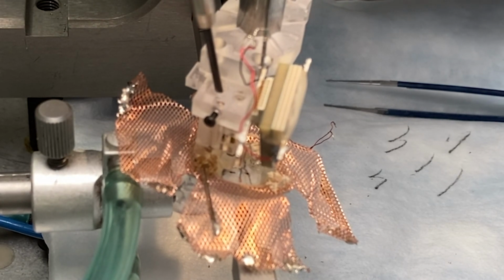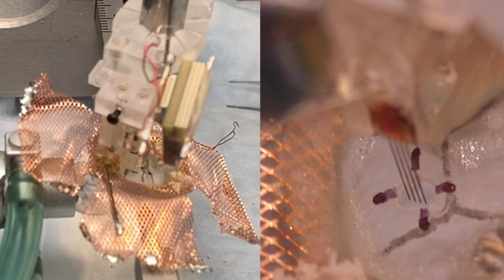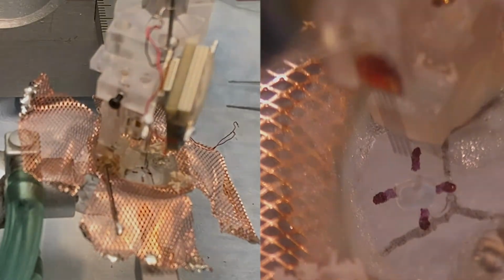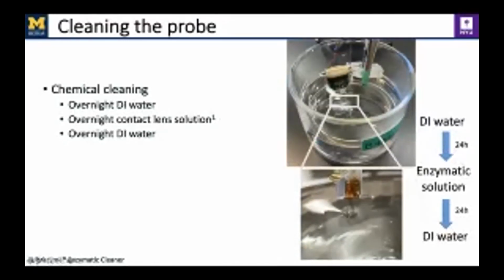While you are doing any of this procedure, please try to keep an eye on the shanks all the time, because if you see any movement of the shank, so here you can see as I am moving up with this device, or you start losing the parallelity of each shank, then you need to stop and look at your environment to see whether there is any problem around.